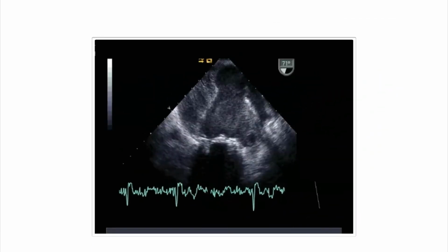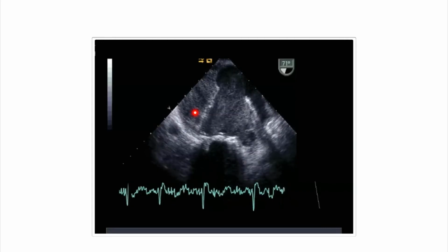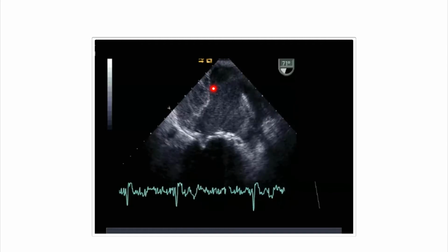A very spectacular echocardiogram in a patient with atrial fibrillation and with stroke. Why does the patient have stroke? I think this is pretty much a no-brainer. If you take a look at the left atrium, it's full of clots. This is an organized thrombus right here.